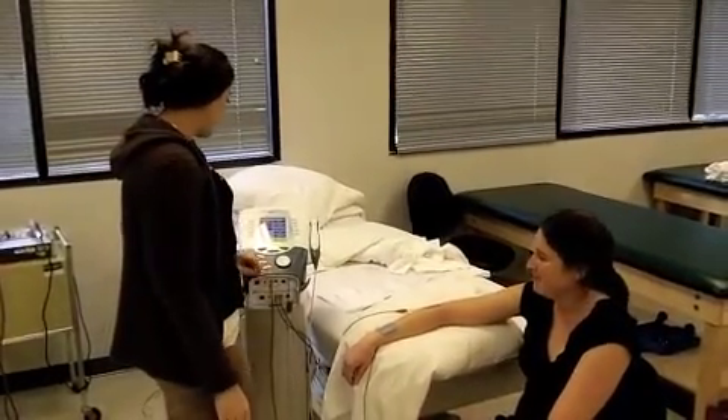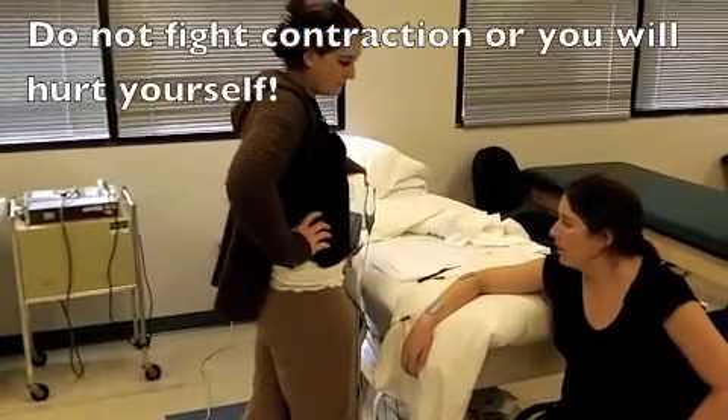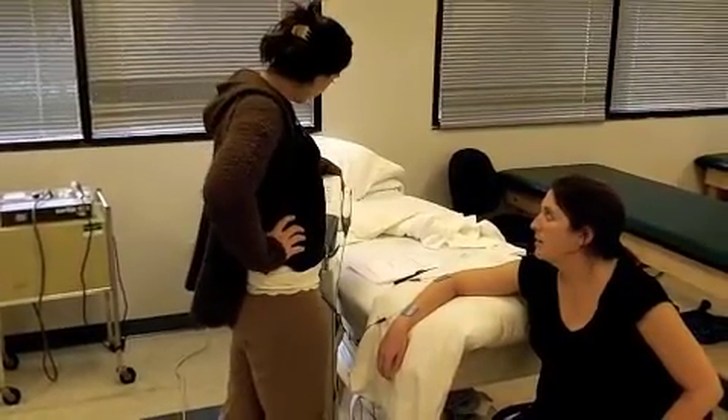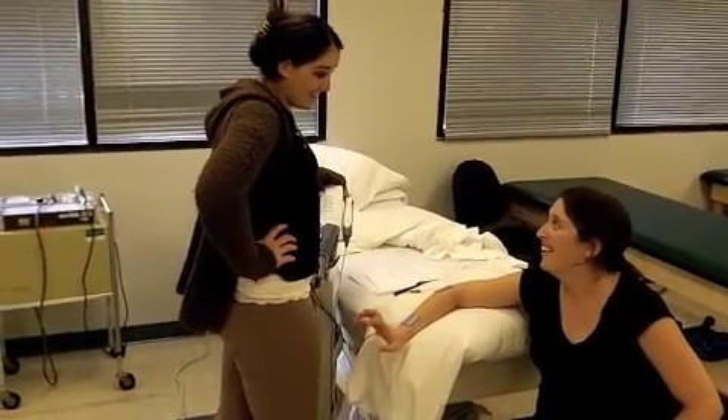I'm going to start to turn it up. And when you feel the contraction, you go with it. It's 412, 747. I'm going to start to turn it up. There we go!